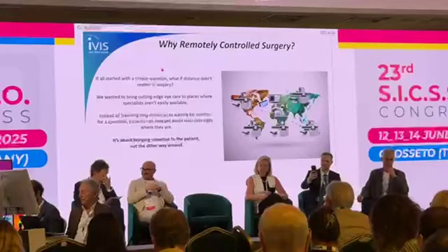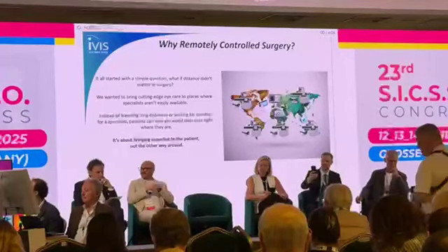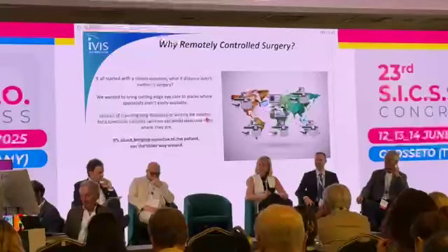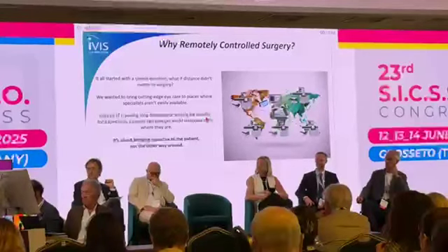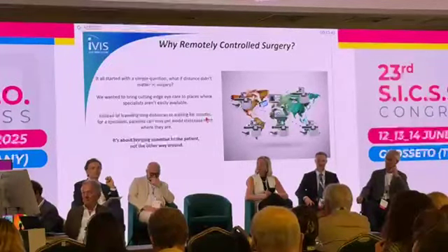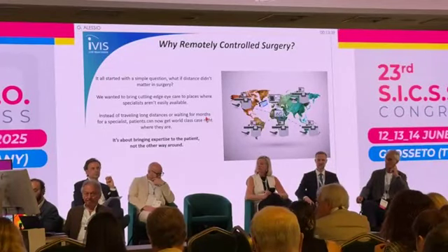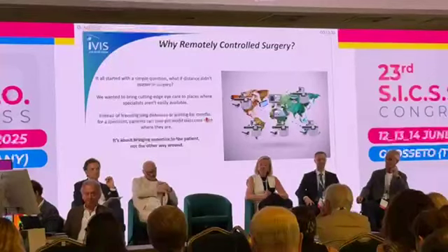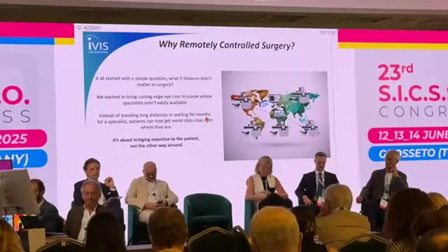we have a possibility to read the slide. The innovation is the surgery with remote control. What does it mean? It has many advantages, I suppose, in our opinion, but in general too, because it started with a simple question. The question is, what if distance didn't matter in surgery? This is a very important idea.